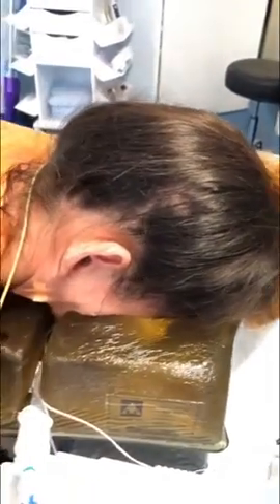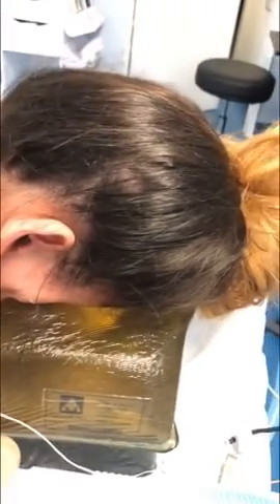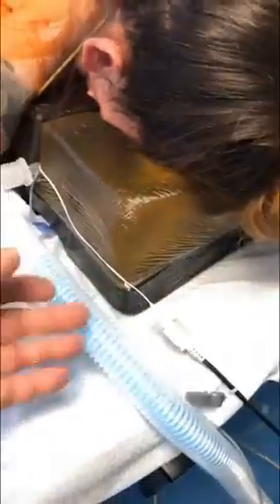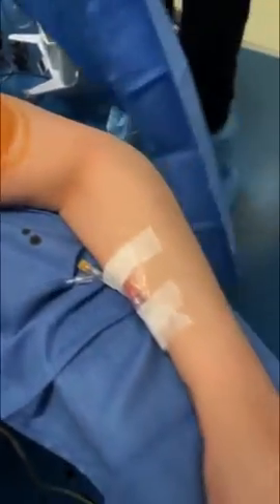So we're going to start the operation in the prone position. We flipped her over prone using four people. We have this special pillow — like jelly kind of stuff here, it's really great. Endotracheal tube cutout here, it's coming through there. This is our thermistor for our esophageal stethoscope, and we have our arms at no greater than 90 degrees and supported well. Everything's looking really, really good here.